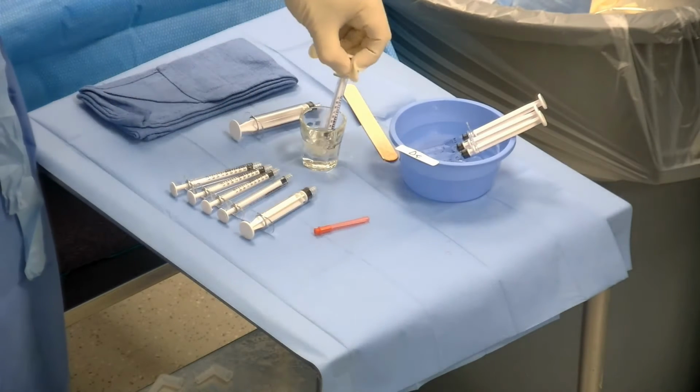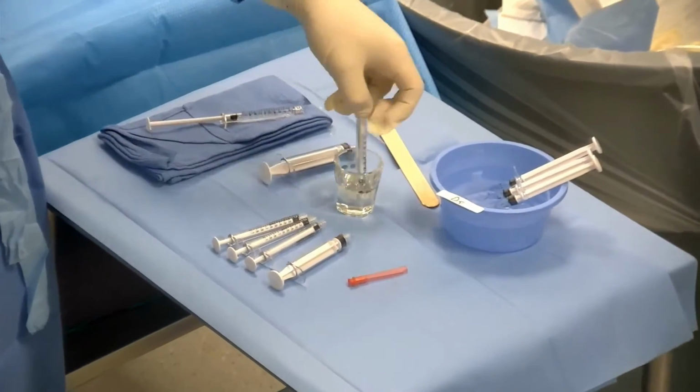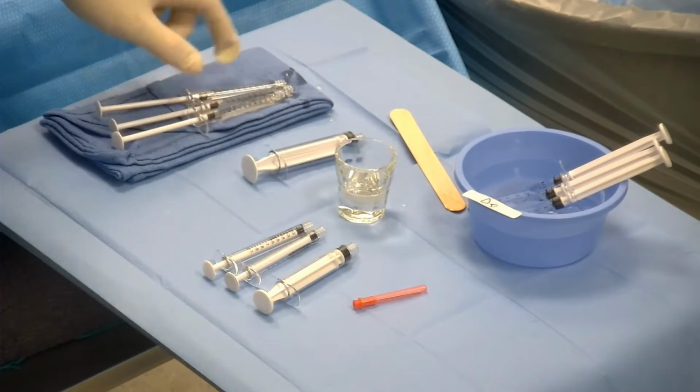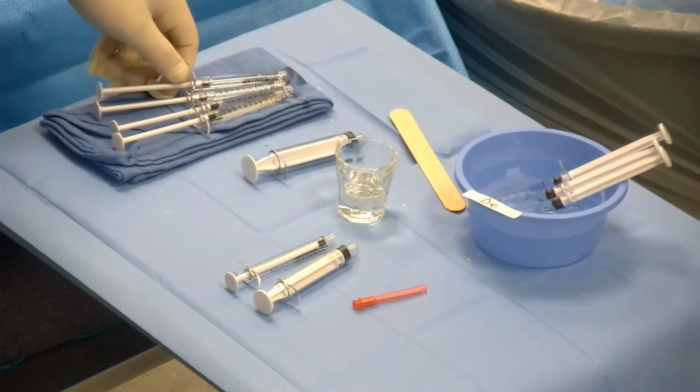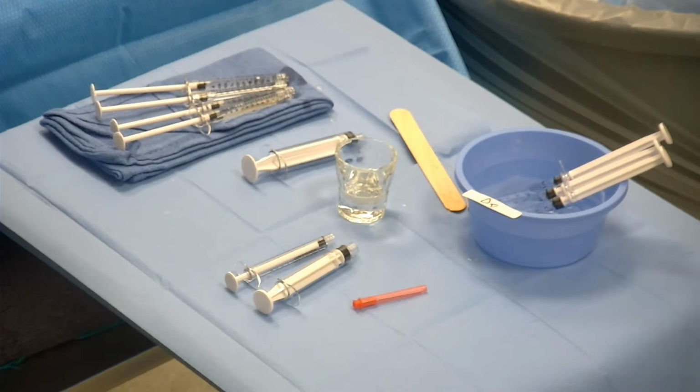And so I'm going to take 1 cc aliquots. I'm going to lay them over here. I'm going to try to make sure that we keep this separate. We don't want to contaminate this with any blood or saline. I think this is probably enough to start with. We're not going to use all of this. And then in this bowl, we have our D5 water, which we're going to use as flushes.